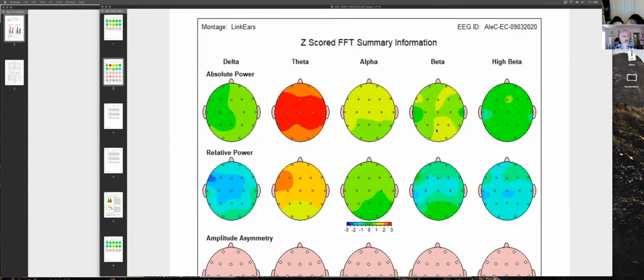So the more visceral worry is probably from the back, it's the posterior, and the stuckness is from the front. So I call this perseveration and rumination. It looks like you have some aspects of both, and the rumination appears to be a little bit worse, the more visceral worry and chewing at things. Rumination is posterior? Generally, yes. The posterior cingulate is the rumination, and the anterior cingulate is perseveration.